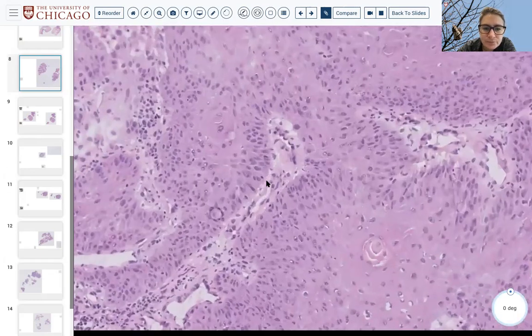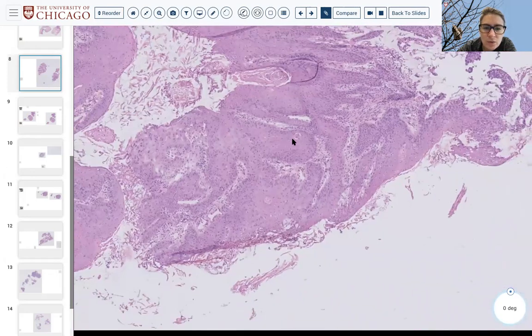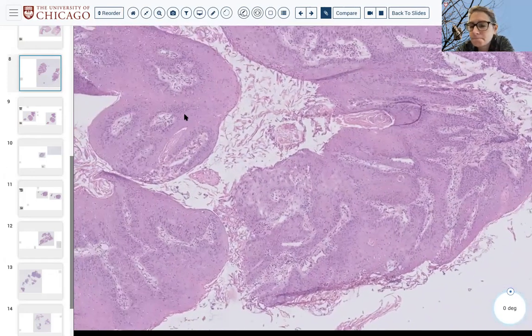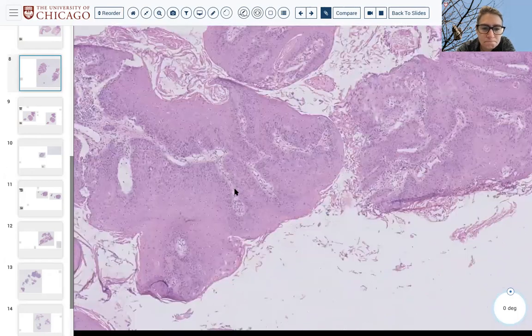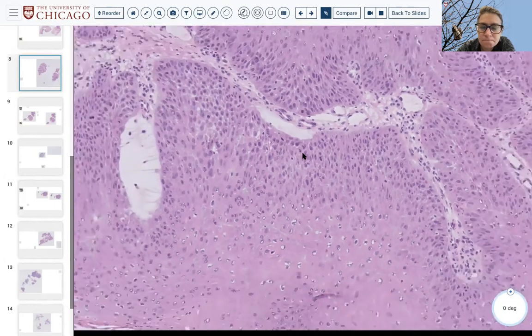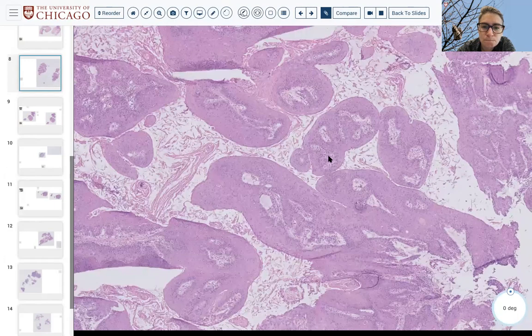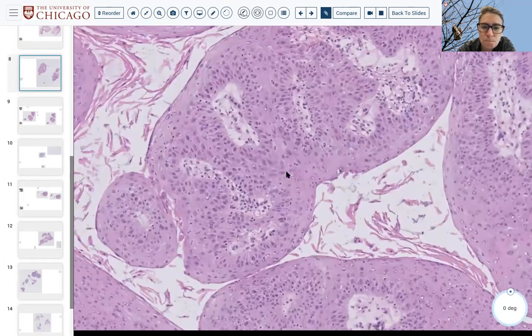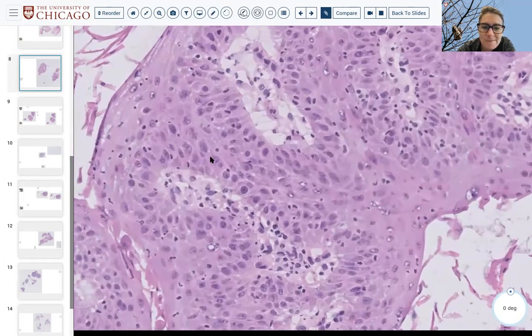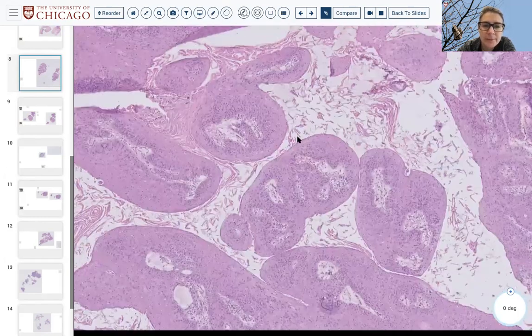Ooh. Sometimes, go ahead. Oh, I forgot what that is, the verrucous something that grows all along your gingiva. Yeah, that thing, PVL. And then this definitely looks like it could be invasive foci every now and then, or at least high grade.